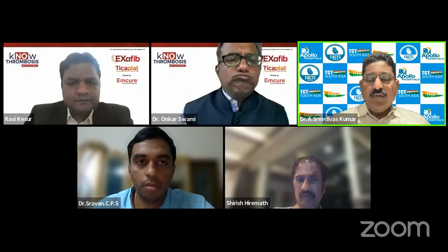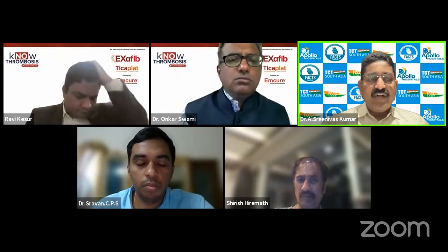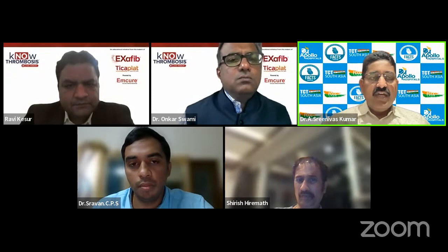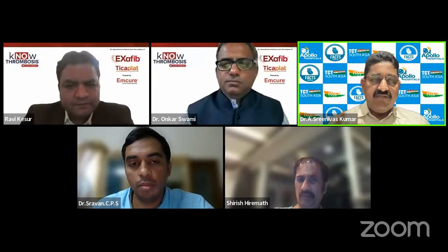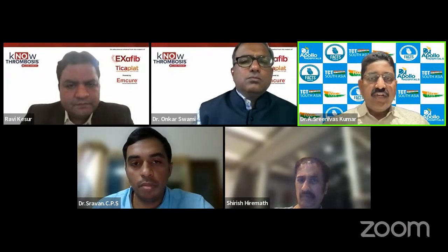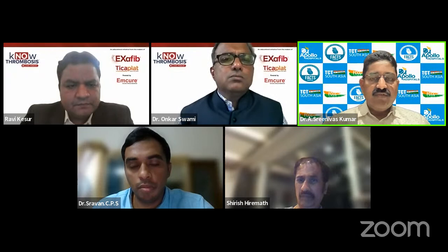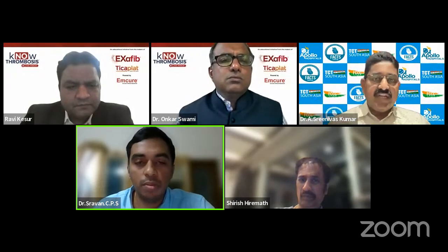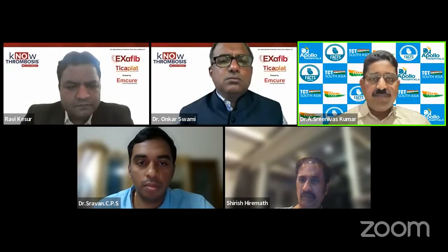Yeah. During COVID times also, we were getting a lot of cases. We did use this device. One more advantage of this Penumbra type is it's done faster, because in COVID times, with AngioJet, it takes about half an hour for it to pump and then get the solution back and all that. This we used to do relatively faster. So that was another advantage quoted with Penumbra. And our hospital also has some stroke cases, acute stroke interventions being done. Yes, the company left the suction device in the hospital. So sometimes a patient may not be able to afford too much, still we use it and offer the benefit to these patients.